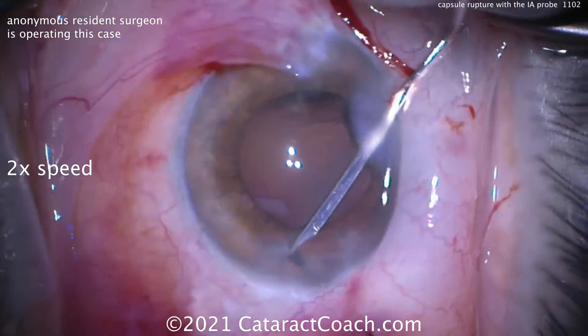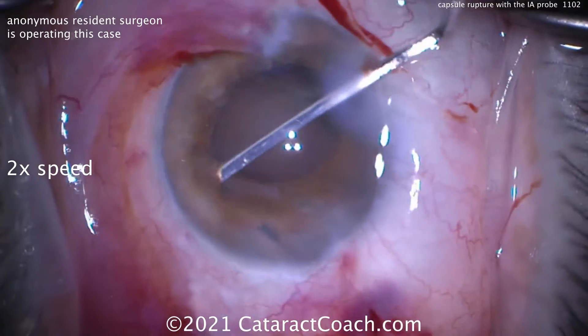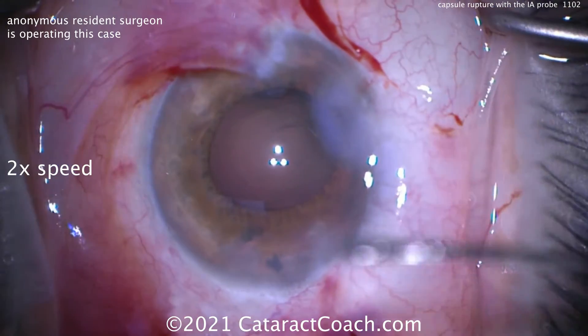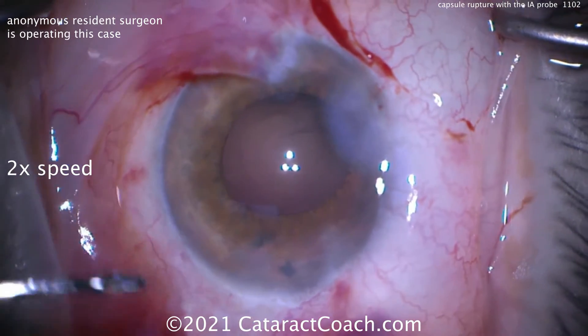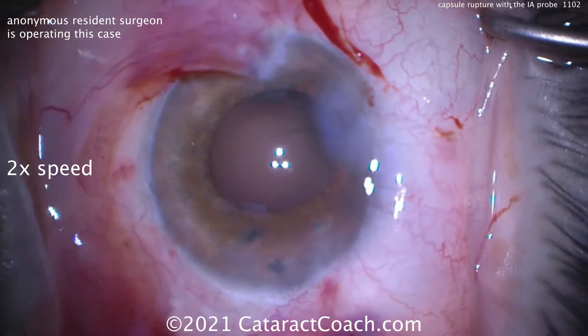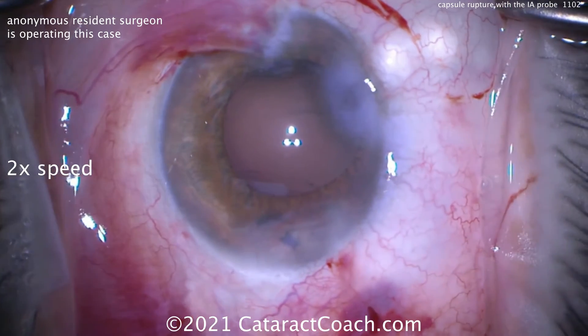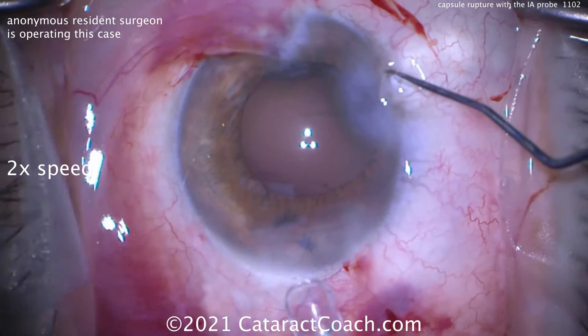You can sweep here — use that and sweep and check, is there any vitreous around? We're sweeping here. I'm showing you the video at two times normal speed now, and there is not. So now the bag's actually clean. There is an opening in the posterior capsule, but there's no vitreous prolapse. You can put triamcinolone on also to check, but remember you've got the viscoelastic there holding everything back first.